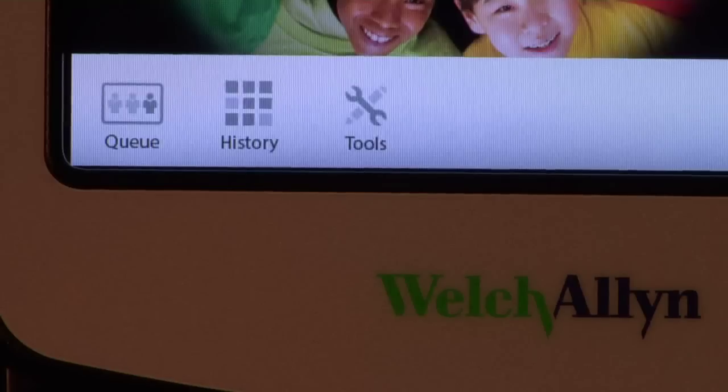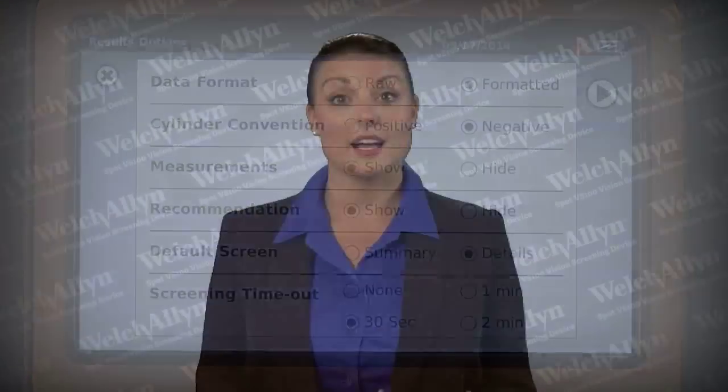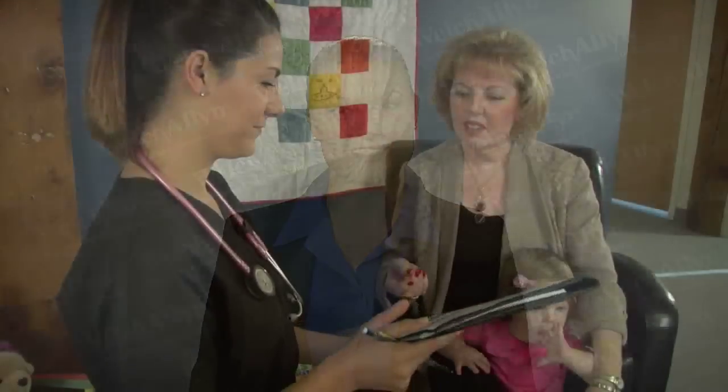Spot provides configurable options to present results that meet your organizational needs. This configuration can be obtained by selecting the Tools menu, followed by selecting the Results menu. Options include defaulting to a Summary screen or the Detailed Results screen, hiding recommendations or measurements, raw or rounded data, and cylinder convention options. A detailed report may be printed on a paper printer in 8.5x11 format for record-keeping and attaching to caregiver referrals. A label printer may also be used for simplified results. For more information on the Welch Allen Spot Vision Screener, consult the instruction manual included with your device.